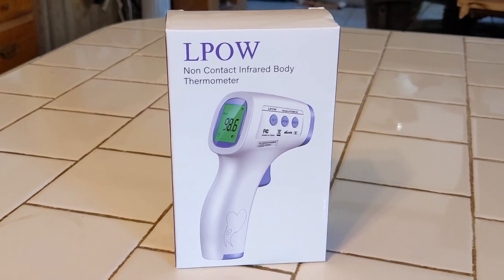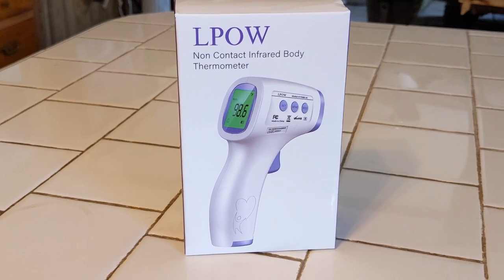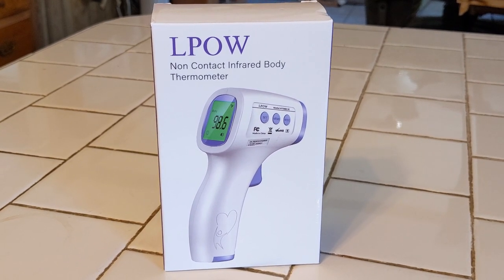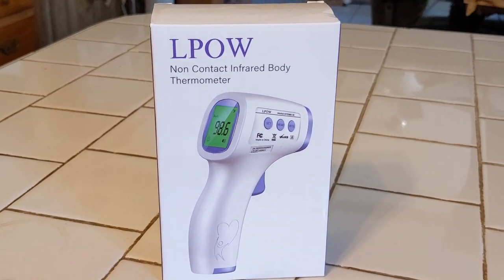This is pretty cool. With COVID-19 going around, I thought it wouldn't hurt to have one of these so you can monitor your body temperature, make sure that you're not running a fever or anything. That'd maybe be the first sign that you've picked up something. So we got one of these.